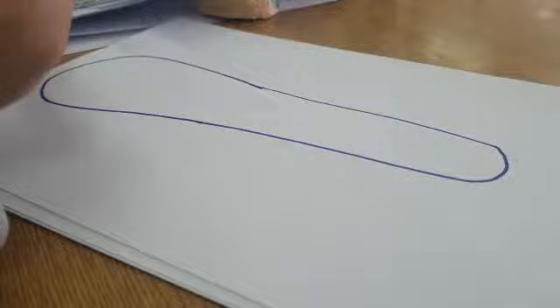Okay, how to retrieve posts begins at the question, why do I need to retrieve it? Many times... This is the crown. And this is the post inside, this is the root canal area, and this is the post inside.